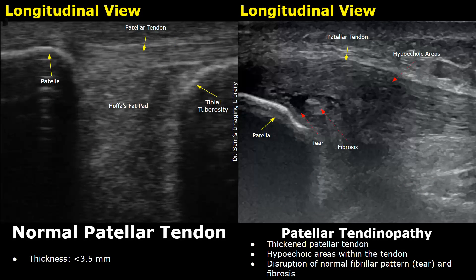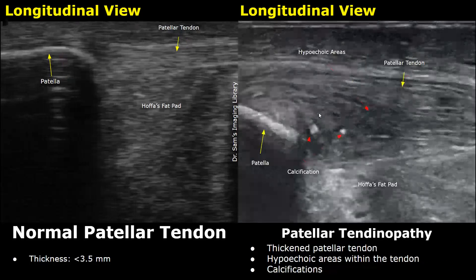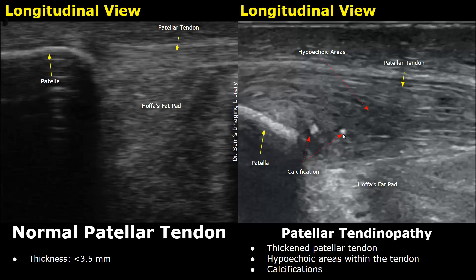This is another case of patellar tendinopathy. The thickened tendon is filled with hypoechoic areas and a tear is present. There is also fibrosis, which means it is a chronic case. In chronic cases of patellar tendinopathy, calcifications will be found. The tendon is thickened with hypoechoic areas, and this has occurred at the proximal aspect of the tendon where it attaches to the patella.